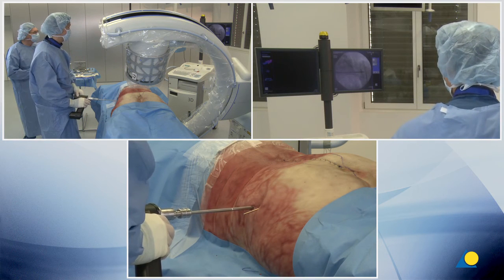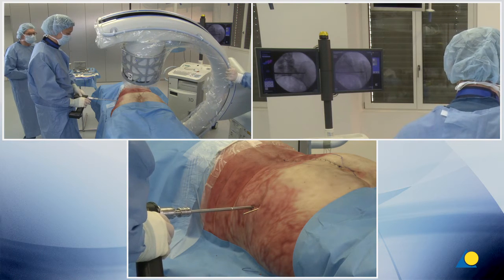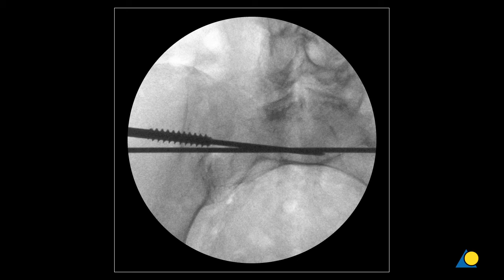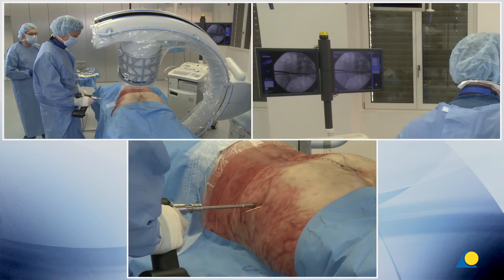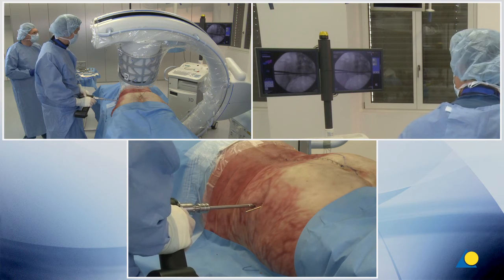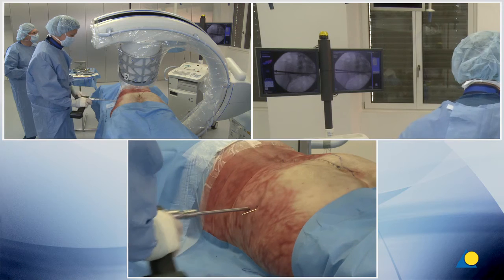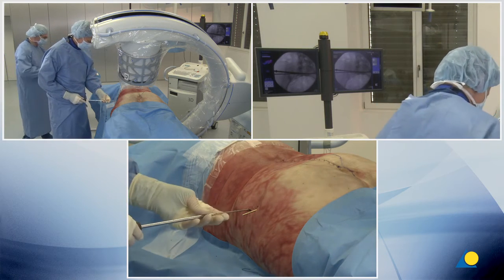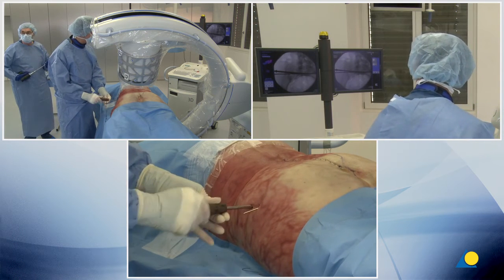The progress of the screw insertion is monitored with the C-arm to confirm it is following the guide wire and that the guide wire is not being driven further into the body and causing potential damage. It is acceptable to use a washer to prevent intrusion of the screw head through the outer table of the ilium and potential loss of fixation.